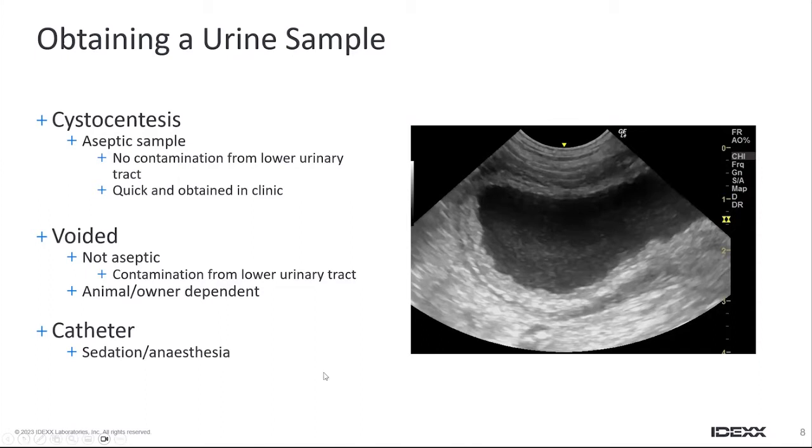And this allowed me to see that actually there was evidence of changes within the bladder. So you can see on the right-hand side of your screen here that we've got the black contents of the bladder, that's the luminal contents, which are quite echogenic, so quite cellular. And we can see that the lining of the bladder is quite irregular and thickened. So we knew there was definitely a problem, and we were to advance with our investigations for that.